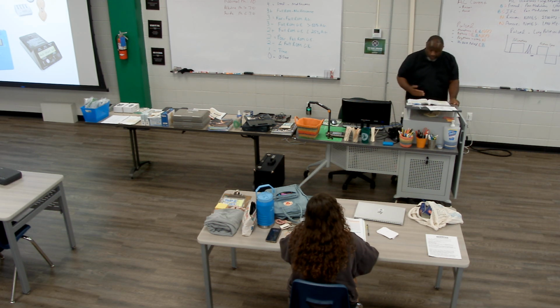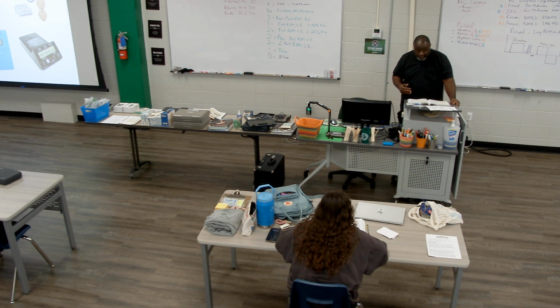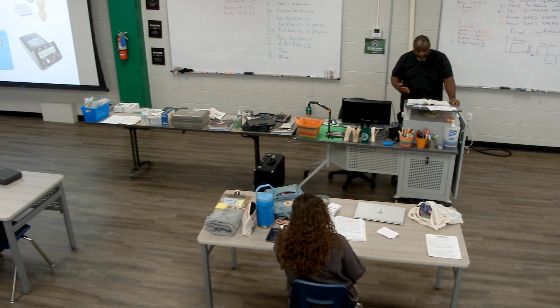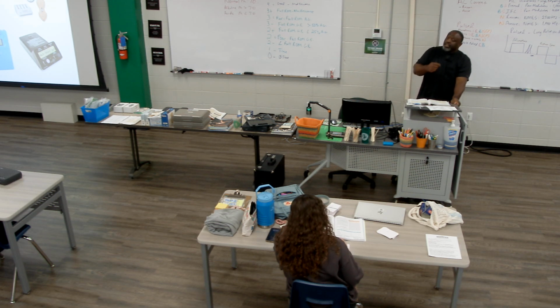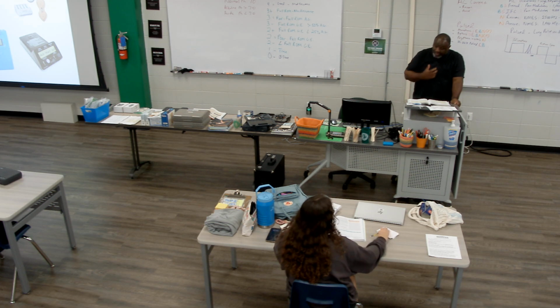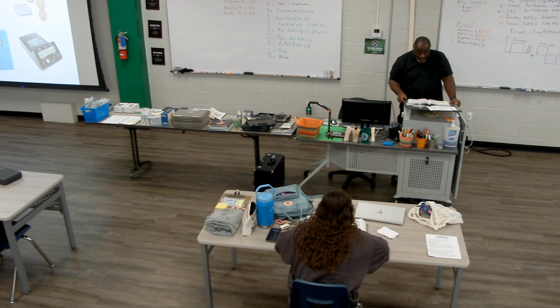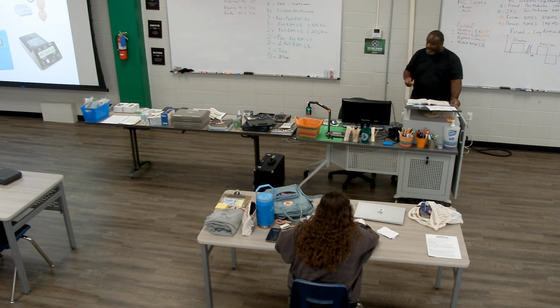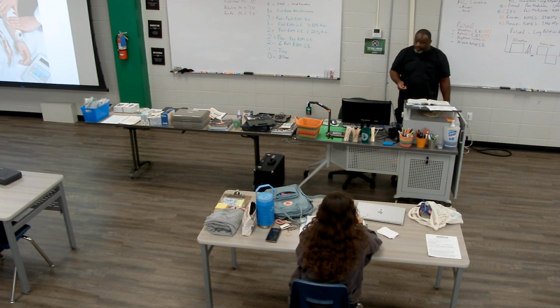Iontophoresis devices are going to be constant current devices, and their job will be to adjust voltage based on impedance so that the current stays constant. In the event of poor contact of the electrode, manufacturers have incorporated auto shutdown. It'll stop it, but even if it's peeling up, it's still going to run the same. So you have to make sure the electrodes are well adhesed to the body. Now, iontophoresis is going to be calculated differently than anything we've done so far.